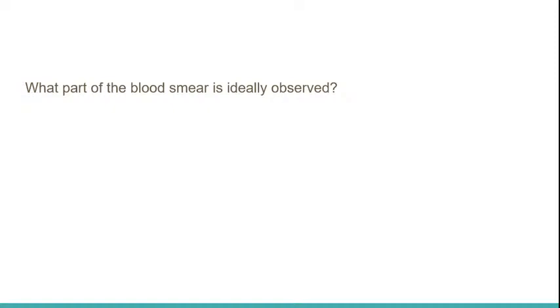A feathery edge, and that's because the analysis or observation of peripheral blood smear is done on the feathery end of the film, or what we call the corona. Okay, so if you made a, let me check first if I can make a drawing here.